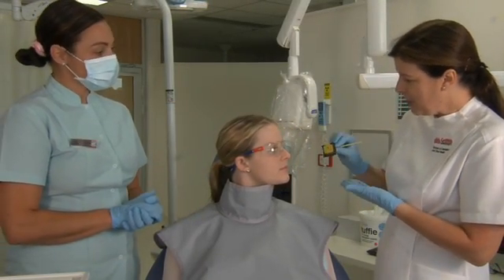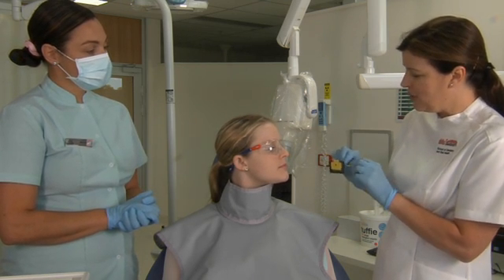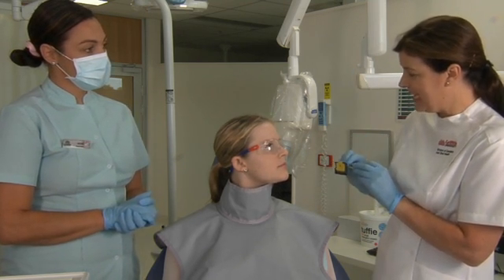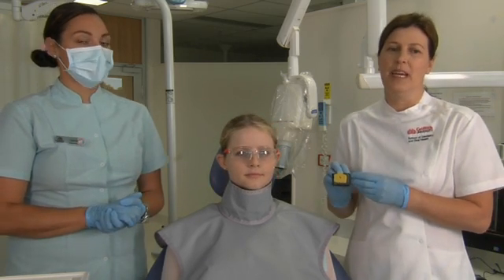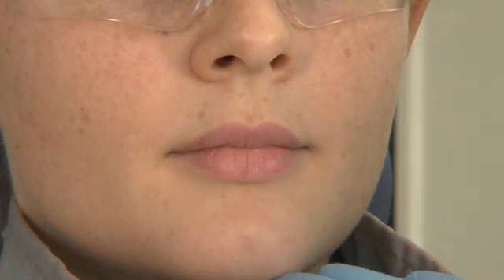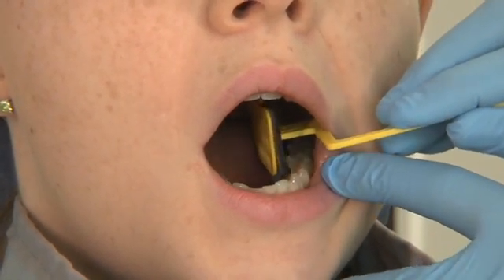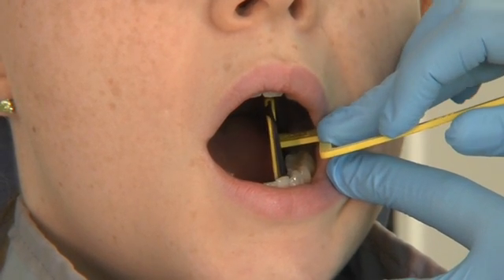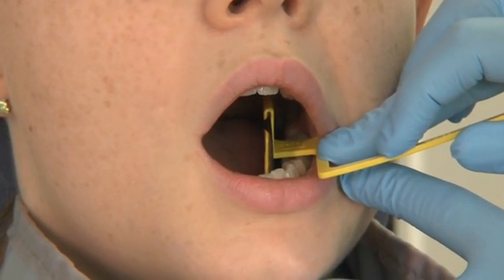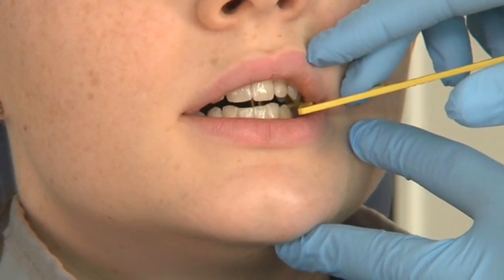So Natalie, what we're going to do today is gently place this into your mouth — it may be uncomfortable just for a few seconds. We're going to get you to bite firmly on the bite plate, and then I'll line up the x-ray, and we'll pop outside for a few seconds to take the film. This is an important part of radiation safety: all personnel leave the room at this time. I'm just going to rotate the sensor plate gently adjacent to the lower teeth and lateral to the tongue, seating the bite plate directly onto the occlusal surfaces of the teeth. Natalie, close your teeth firmly — this positions our bitewing holder in the correct position.